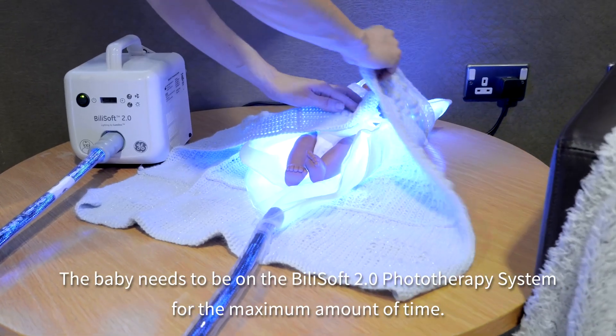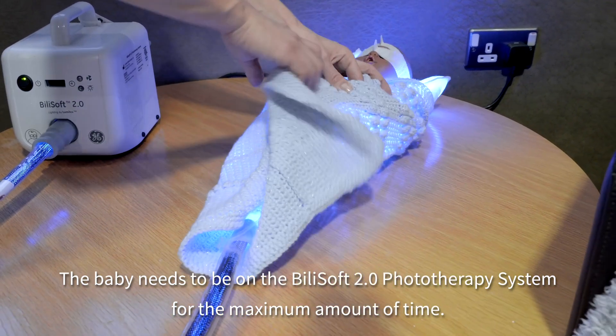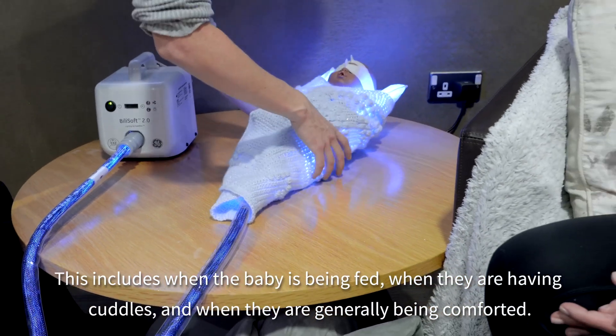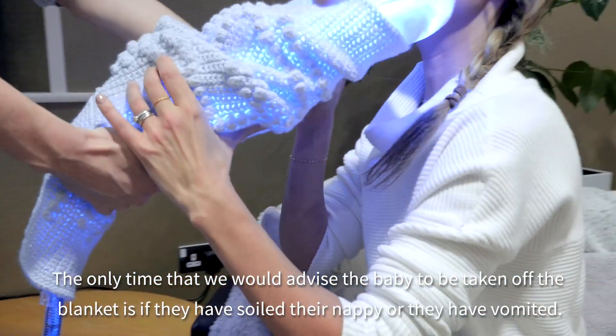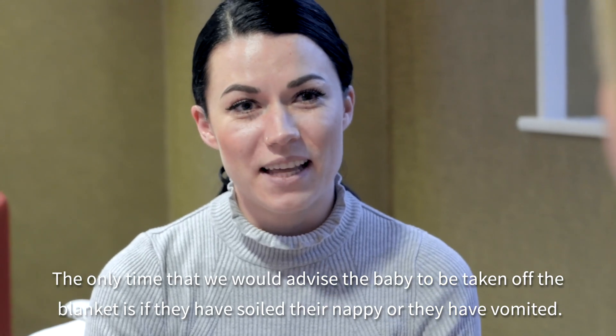The baby needs to be on the Bilisoft phototherapy system for a maximum amount of time. This includes when the baby is being fed, when they are having cuddles, and when they are generally being comforted. The only time we would advise the baby to be taken off the blanket is if they have soiled their nappy or have vomited.